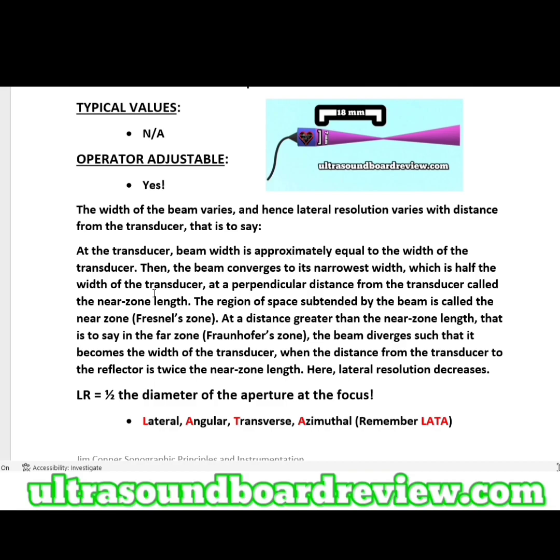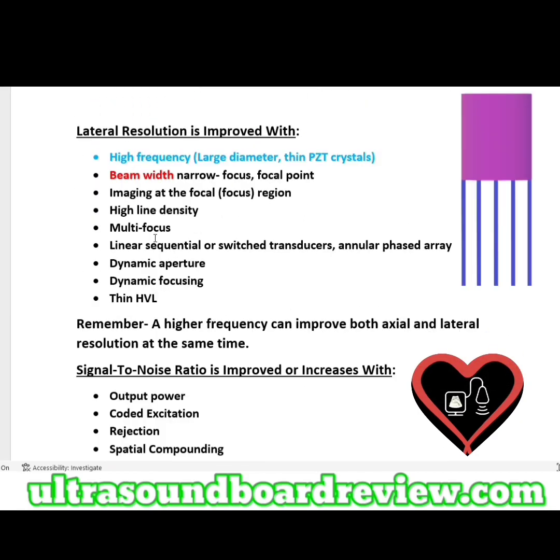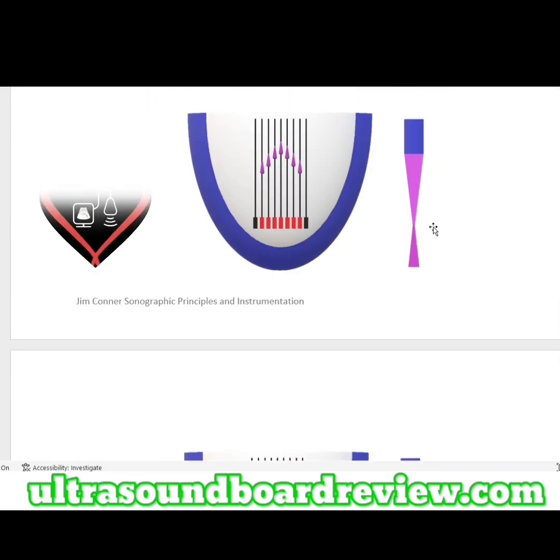So if they said, how do you improve transverse resolution? You're going to look for narrowing the beam, high line density, and imaging at the focal point or the focus. The focus is right here, right where the beam is the narrowest.